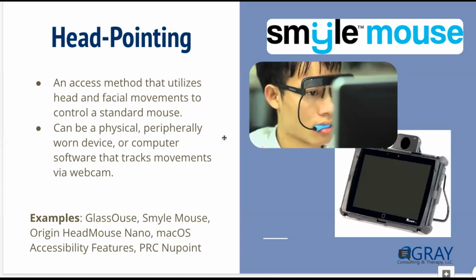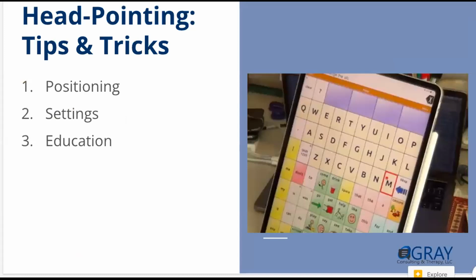It works with iPad and anything that's Bluetooth accessible wonderfully. And can be a really great option. And the things, this again, are like that positioning piece, being able to really use your neck fully for that and be well supported so that you can.